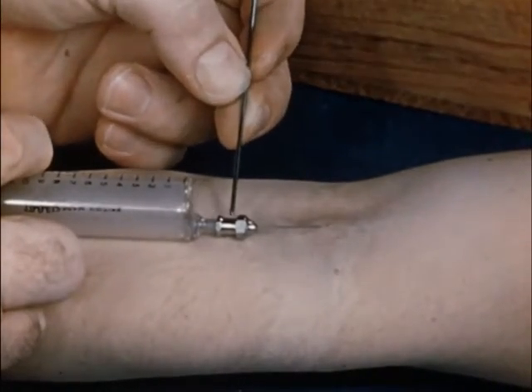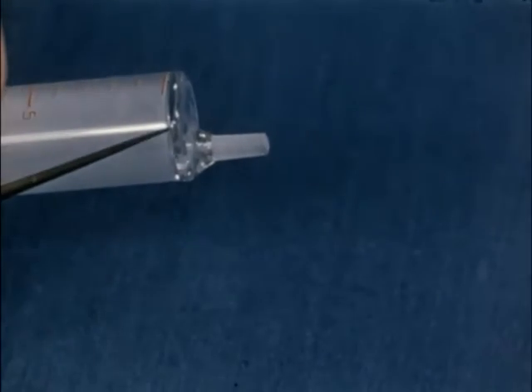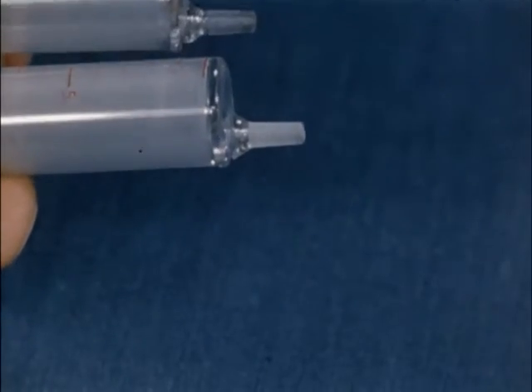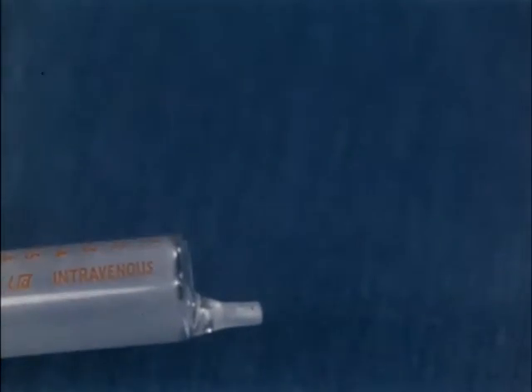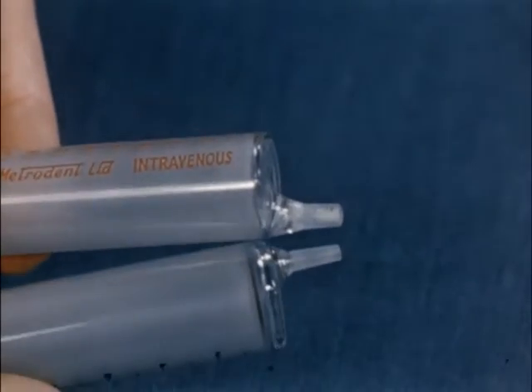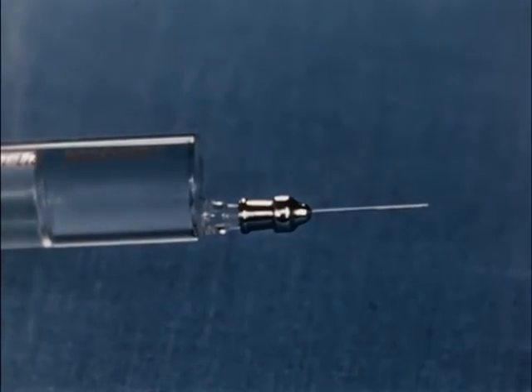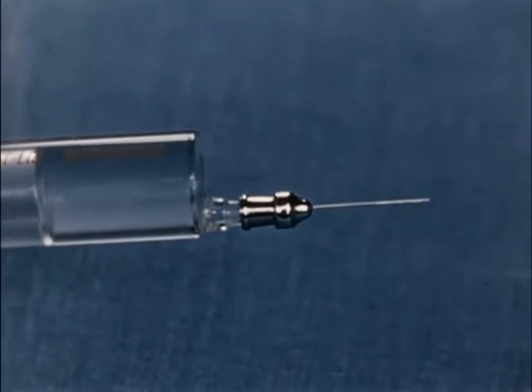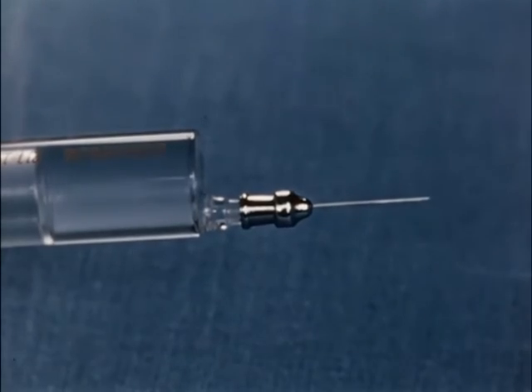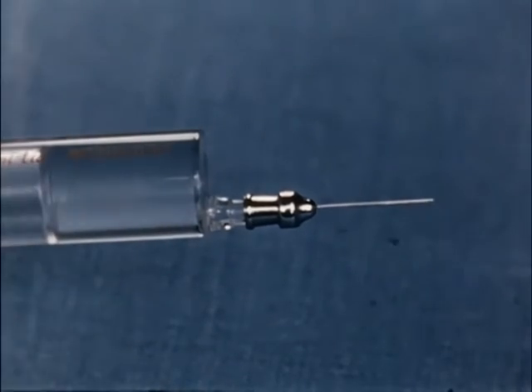This nozzle test can be made as frequently as desired throughout the injection. There are several makes, equally suitable so long as the plunger, barrel and nozzle are accurately ground to preclude leakage. Always specify the American lure fitting, as a lure glass nozzle is much more robust than the popular record size. The syringe is light and well balanced when fitted with a fine gauge needle, so that a more delicate technique is encouraged. Much weight is also saved by the avoidance of a heavier needle, metal plunger and metal head fitting.